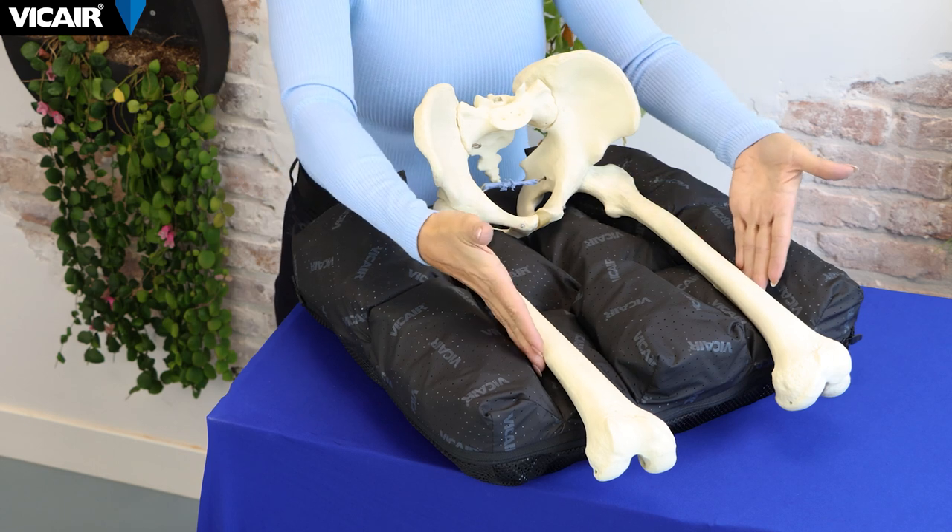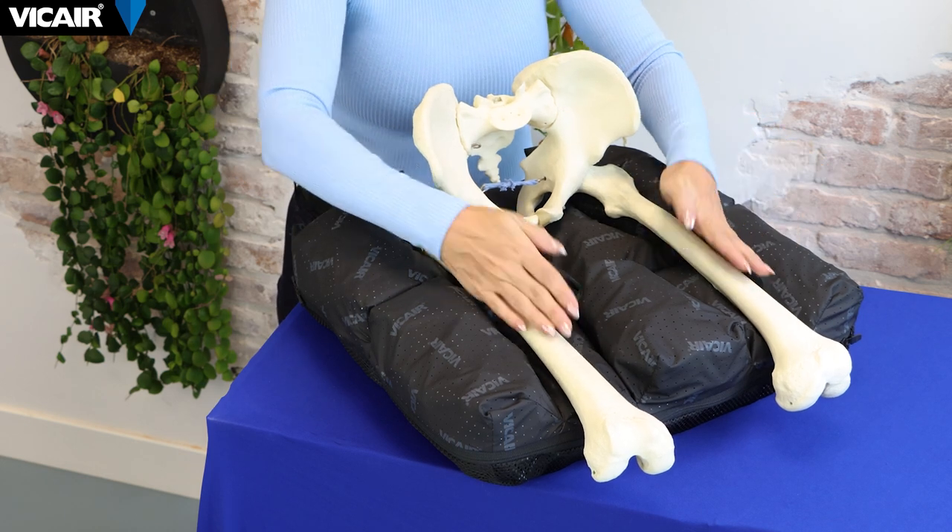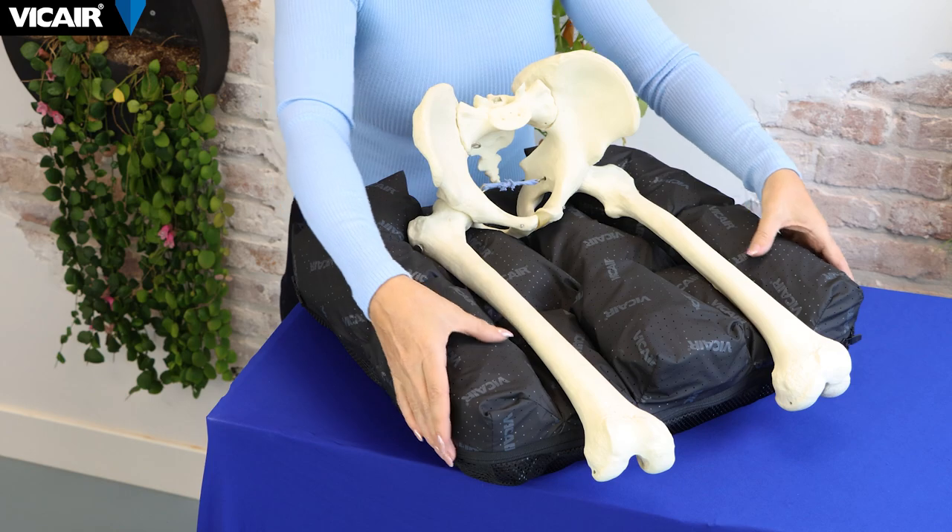The compartments at the front under the right and left femur form a recess for proper alignment of the thighs. The middle compartment at the front provides medial thigh support. The two side compartments at the front provide lateral thigh support. Together, these five front compartments provide optimal leg guidance.